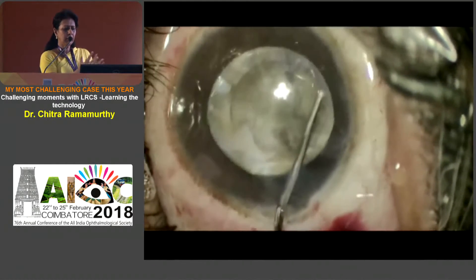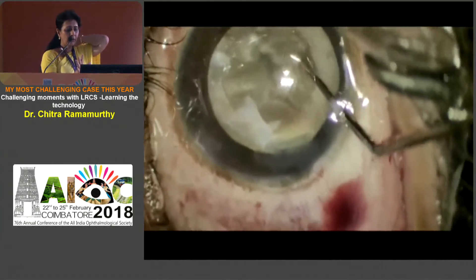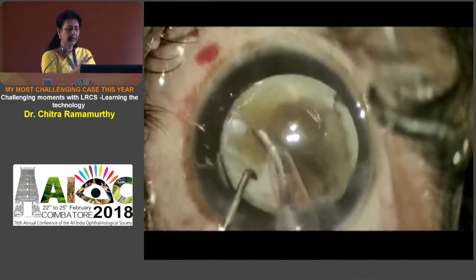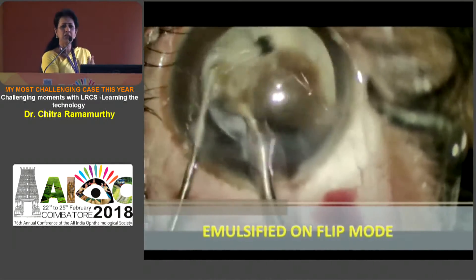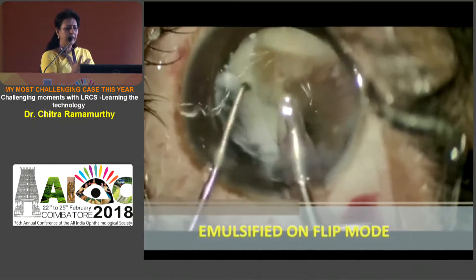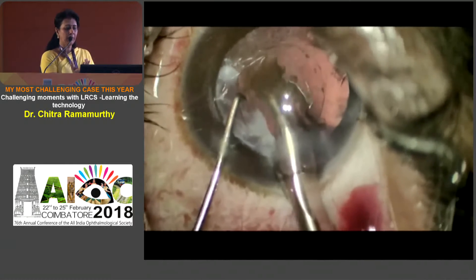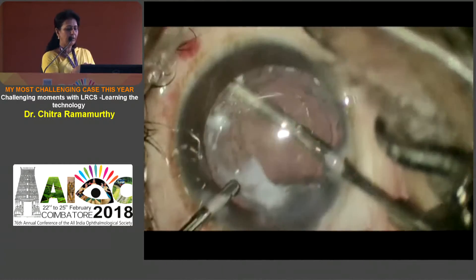The cataract looked quite hard, so I just gently do a hydrodissection at this point of time, and I ensure that the rotation of the nucleus is quite complete, as is necessary. But as I try, you can see it is actually just a disc — not even a hard cataract. I go on to the flip mode and in no time I have gobbled up the thing, because it has been softened and fragmented by the femtocataract platform.